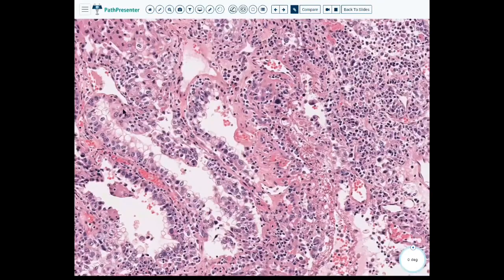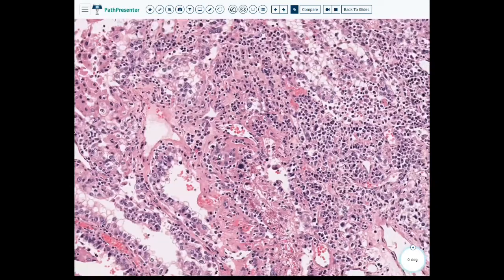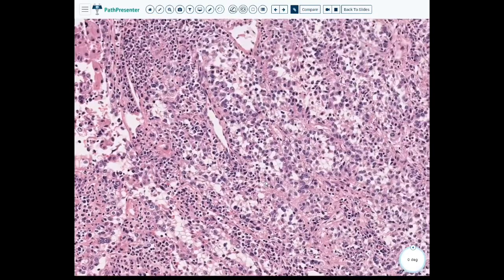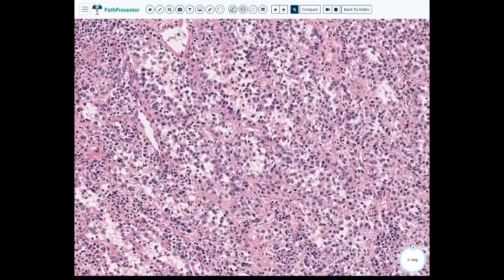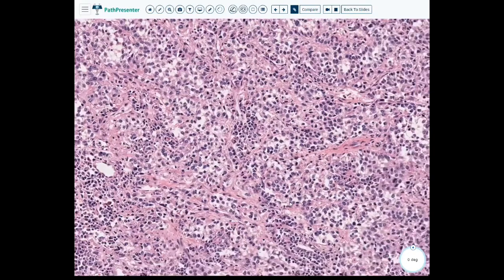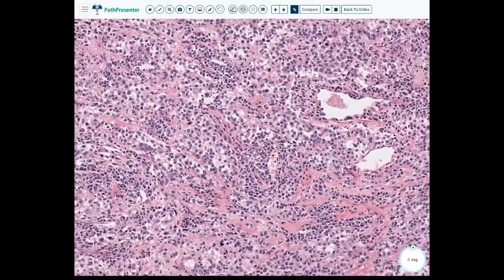This is a little more clear. So that's why I would still have clear cell renal cell carcinoma with papillary architecture and sarcomatoid change as my top differential, but I think it's not a bad idea at all to also consider, is this type 2 papillary renal cell carcinoma with focal clear cell change and sarcomatoid change? You could think about your medullary carcinoma. And this would be an instance where your stains would help you.